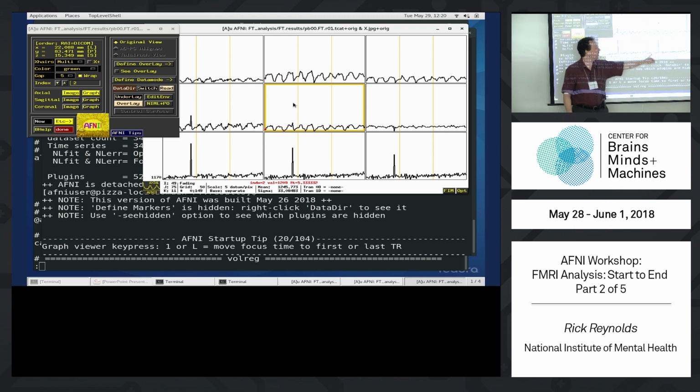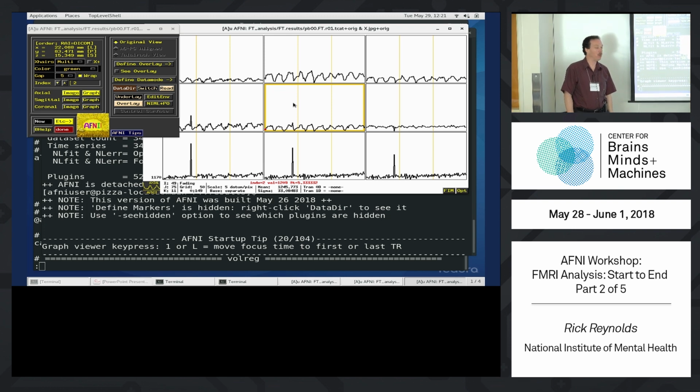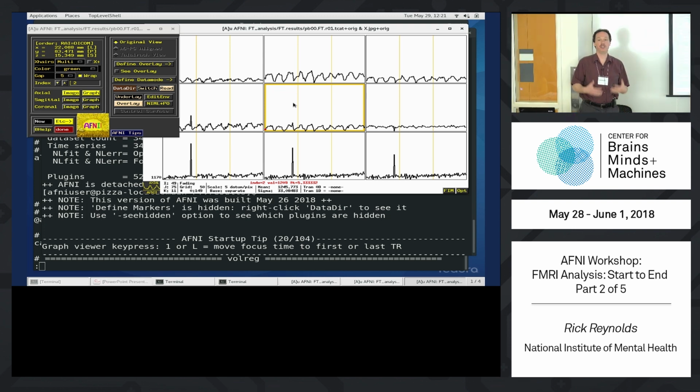But we're doing an interpolation. That means these spikes will be interpolated so they can shift to their neighbors. That's a little irritation. Everything's got good and bad points to it. So the important thing is to bicker a lot until you're satisfied. But just feel comfortable with the choices you make, and know that every choice is going to have problems.